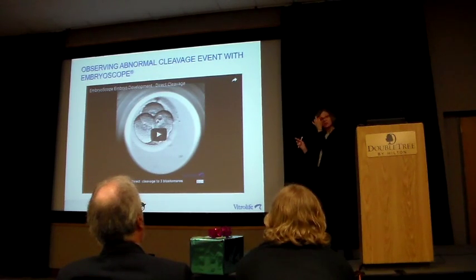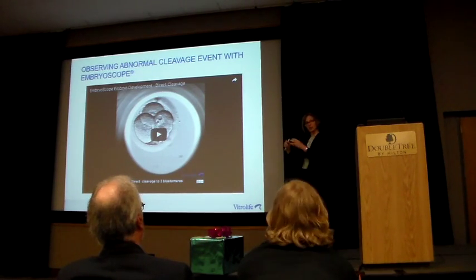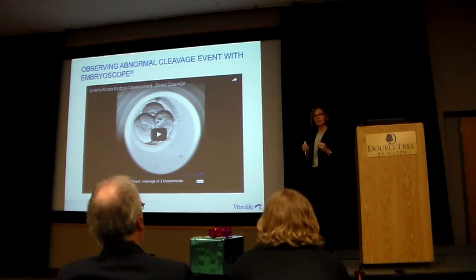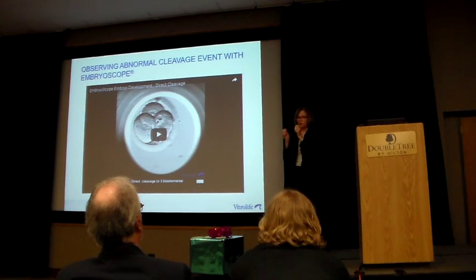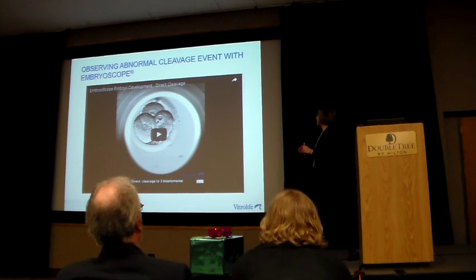Nor would you even catch it. If you did take a dish out and see this 3 cell, you wouldn't know that it was abnormal, because they will sometimes go 1, 2, 3, 4, but it's real fast. So if you see a 3, you don't know if that's part of that normal 1, 2, 3, 4, or if it's 1, 3, and then it hangs out in the 3 for a really long time.